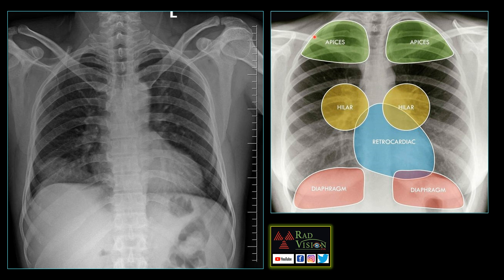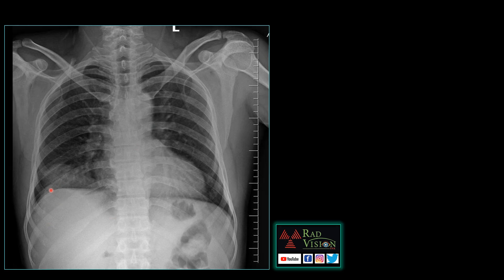The hidden zones in the lung are the apices, hilar regions, retrocardiac location, and below the domes of the diaphragm. We will try to see the image again. You can see there is a homogeneous opacity noted in the right lower zone, but when you concentrate clearly you can see there is a subtle eccentric calcification situated in the right lobe of the liver.